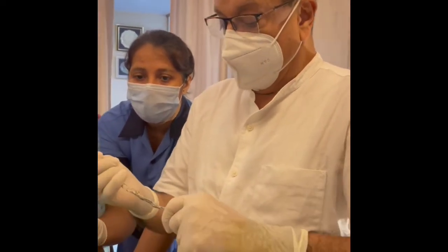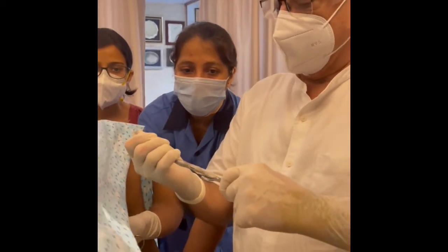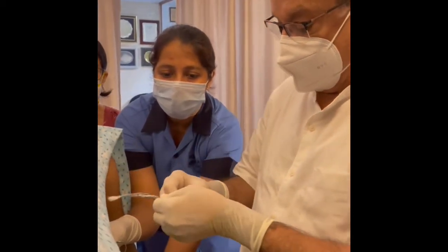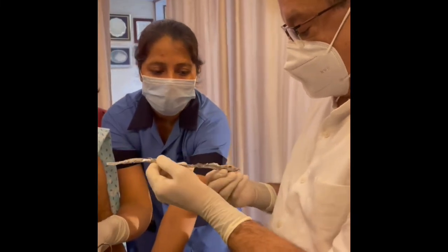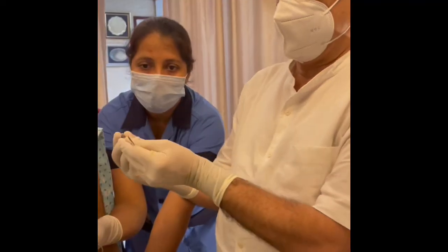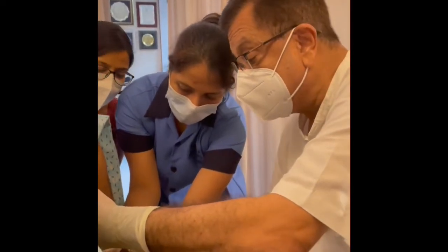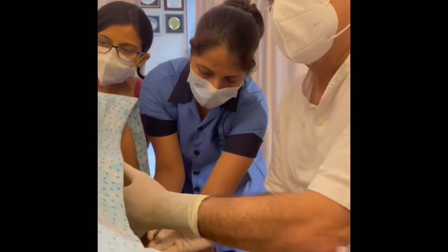You will preform the cannula in that shape and then peel it off. So you will try to match that, and then you will negotiate from the external os.